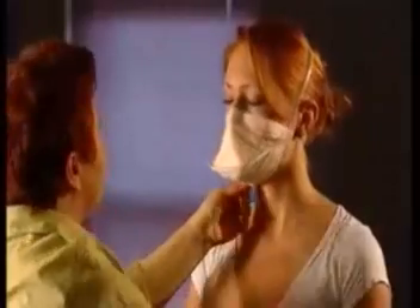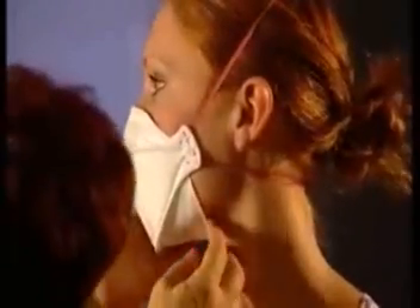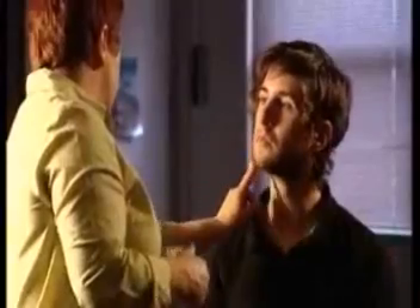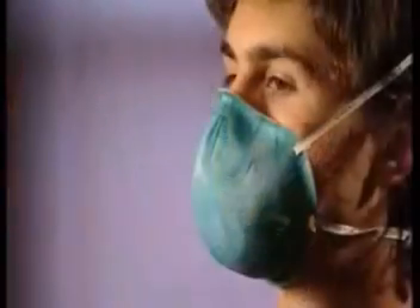Mask selection is determined by facial characteristics such as shape and size. There is no one mask that will fit all faces. Generally, a small mask is selected for a small face and a large mask for a larger face, however there can be exceptions to this basic rule. Facial hair can make wearing a disposable P2 or N95 mask ineffective and unsafe, so users should always be free of any facial hair that may affect the seal of the mask.